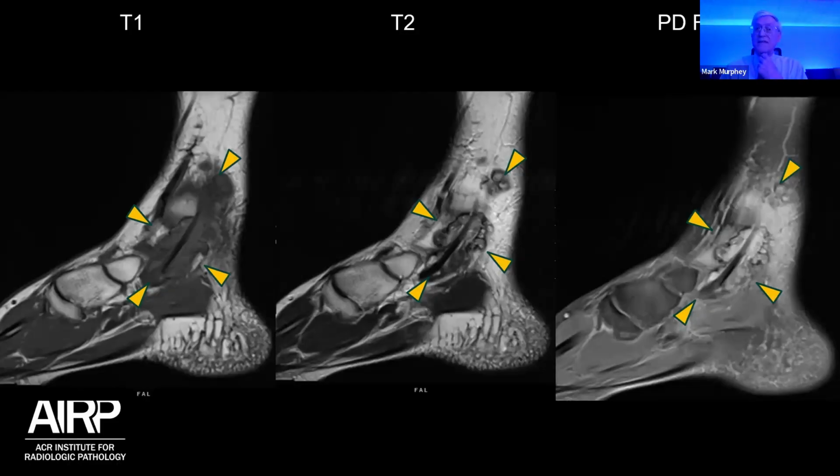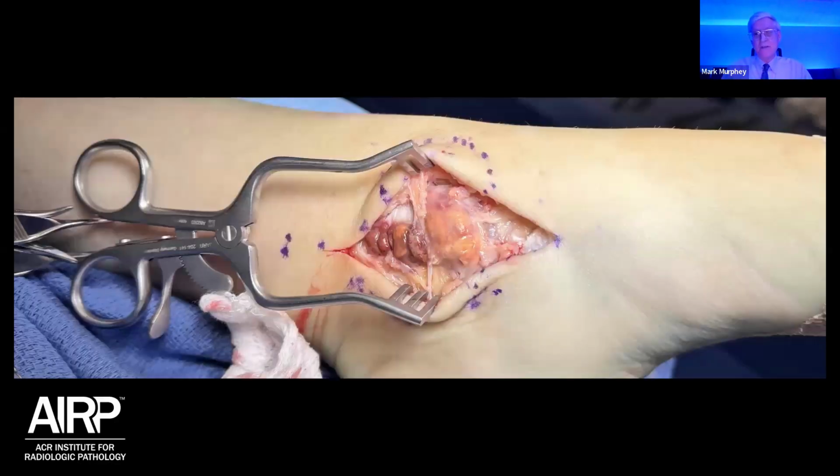Quite important to look at the extent, and we'll see that in just a little bit with the intraoperative pictures. And again, there is the posterior tibialis tendon surrounded by this mass. Here are the intraoperative pictures, and notice us telling them the length of this abnormality tells them how much of a fillet they're going to have to do, because a lot of times this disease is very focal and localized, and wouldn't have to do this big of an incision, but really vital for us to tell them the length of this abnormality, because that determines the length of their incision.